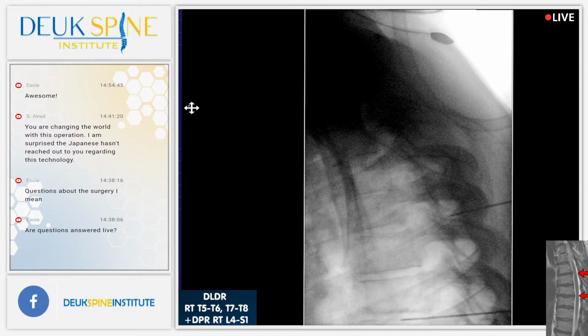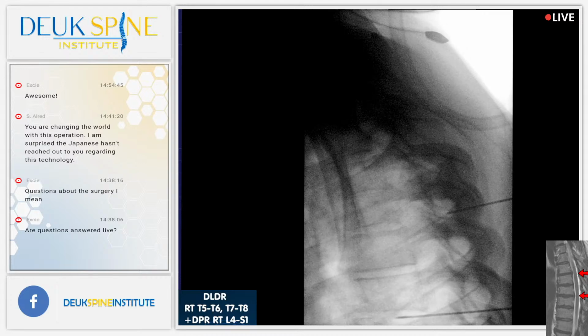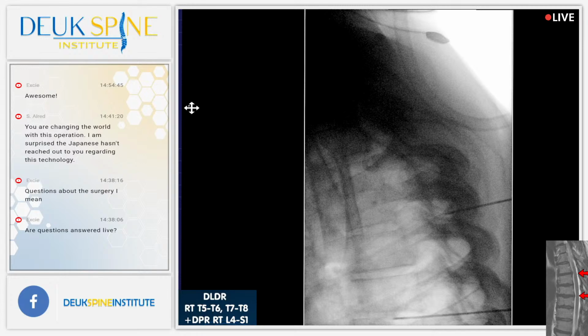All right, you want to show me what you've got, Jordan? Once again, we're adjusting the x-ray, the position of the fluoro relative to the spine. Those are the posterior elements. If you look at 6, it lines up nicely. It's just 5 that's a little bit difficult to see. But 6 pedicles are good. 6 is off on orbit a little bit. Can you reorbit 6? Maybe play with the orbit again. Let's just look at 6. If we can get 6 good, then maybe 5 will come into view. That's a little bit better.